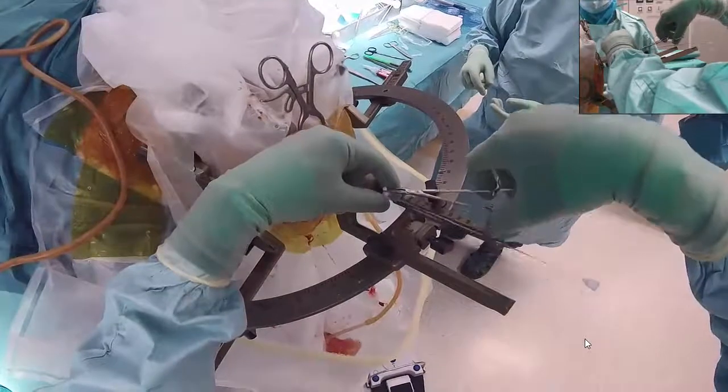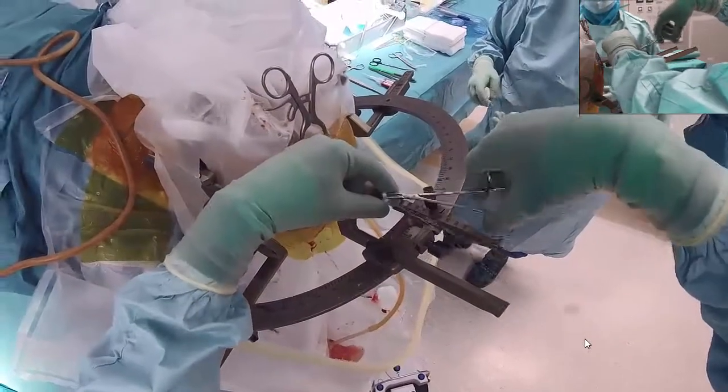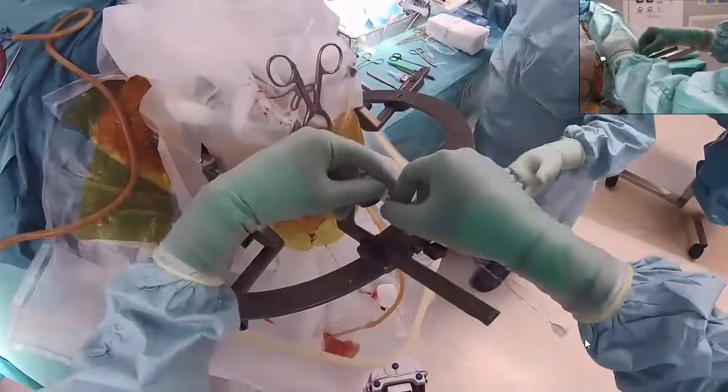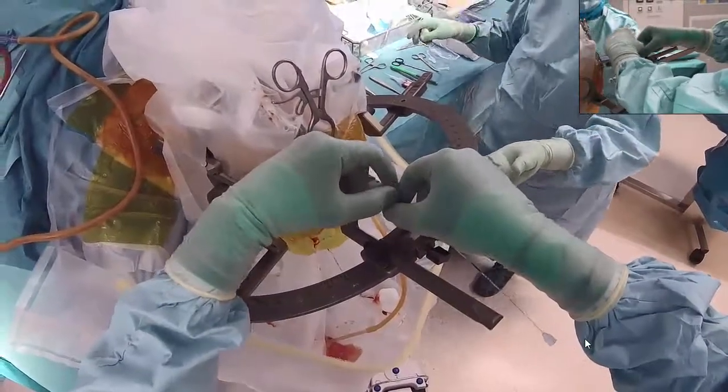With Medtronic, the inner stylet can be removed without removing the stop, but with Abbott you need to first remove the stop before removing the inner stylet.